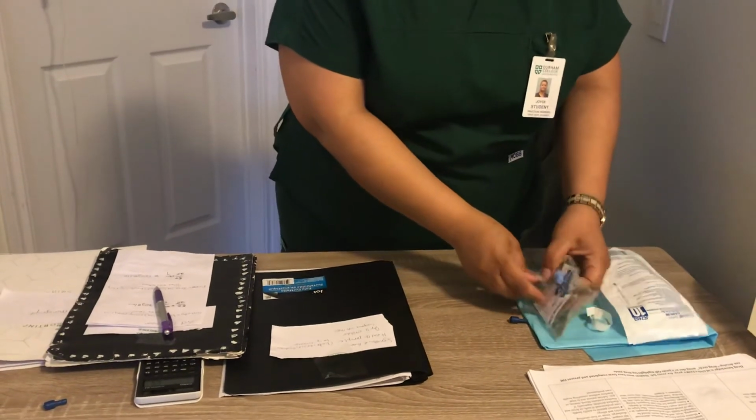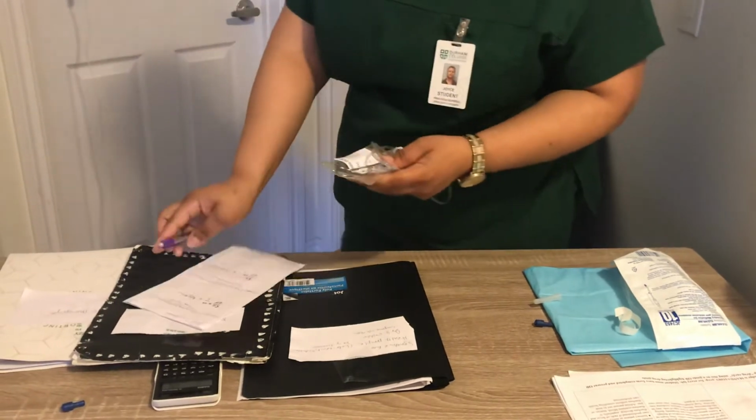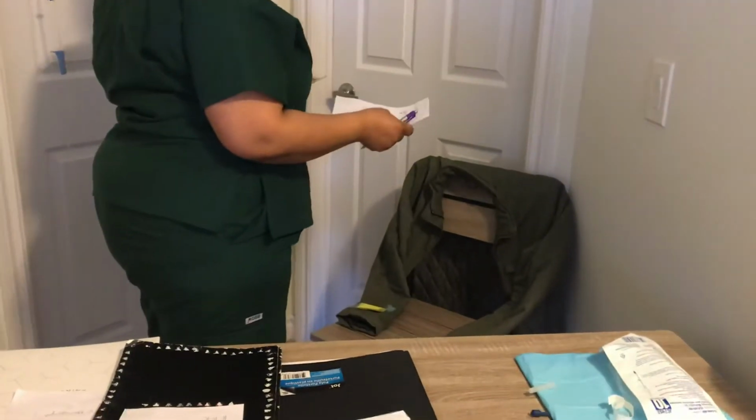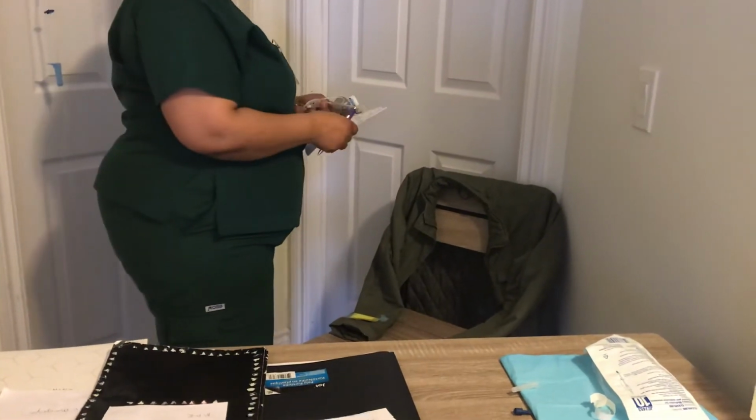I'll take my supplies and my worksheet to my patient's room. Hi, my name is Joyce. I'm a nursing student from Durham College. I'm here to administer your medication. Is that okay with you? Patient is going to give me his consent, and I'm going to do a quick environmental check to make sure that everywhere is free of clutter and safe for the patient.